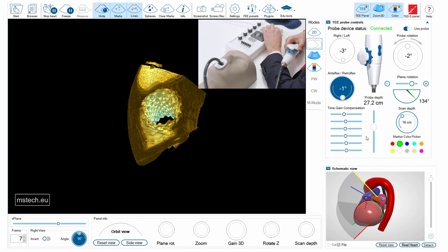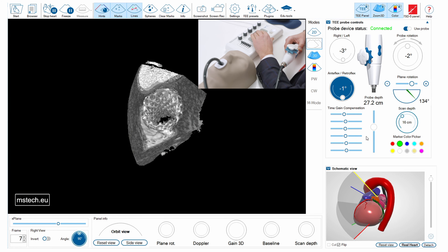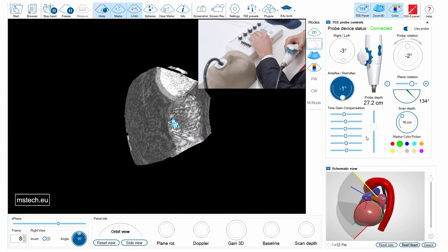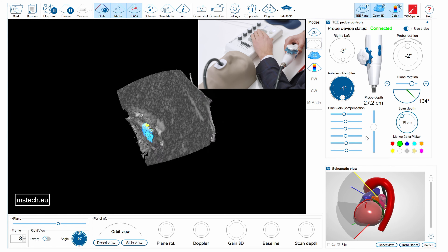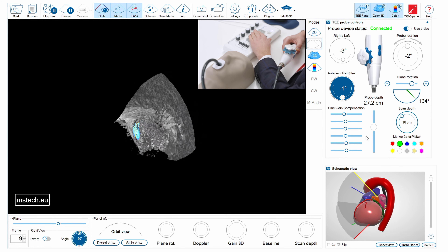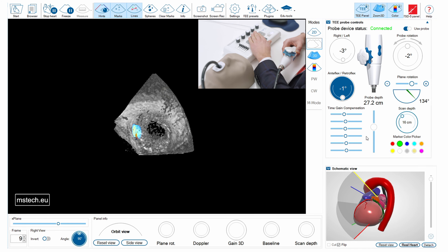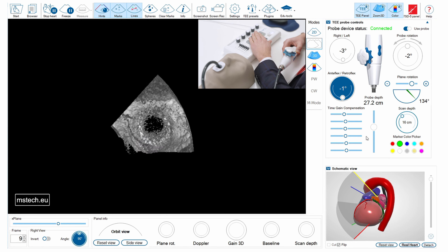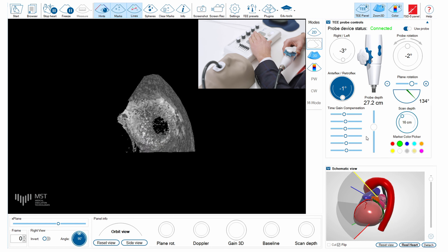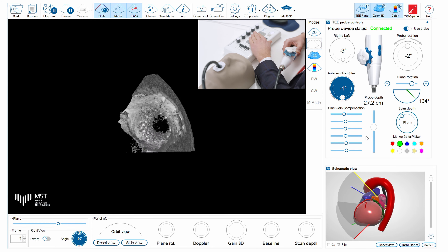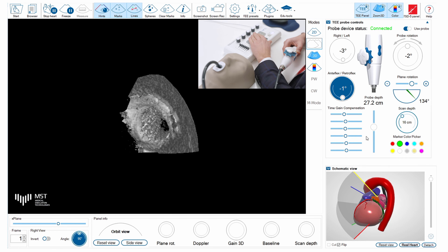And also, to understand better where the leak is located, we can have a look from here and see that there is a little leak close to the mitral leaflet, which is visible on the left-hand side.